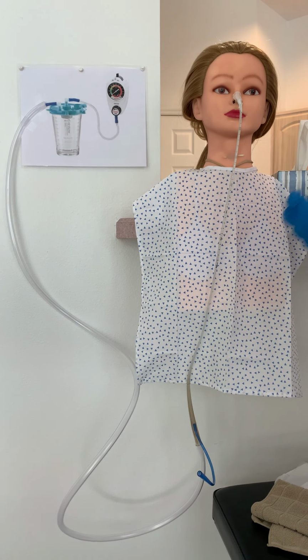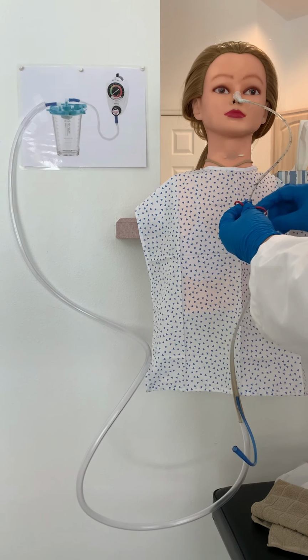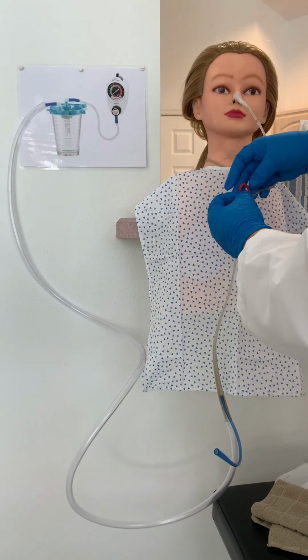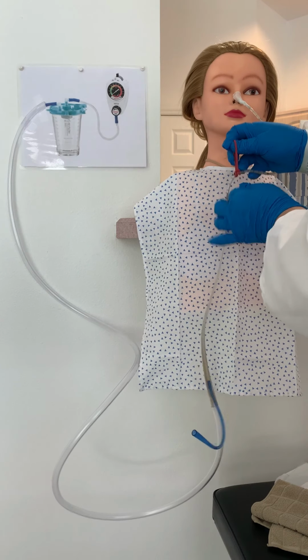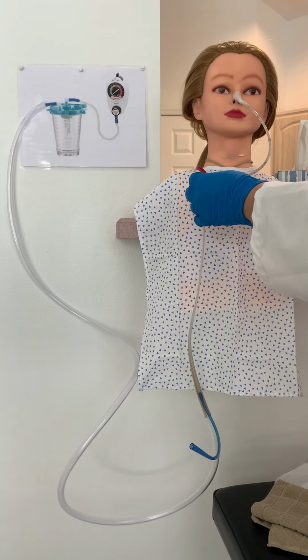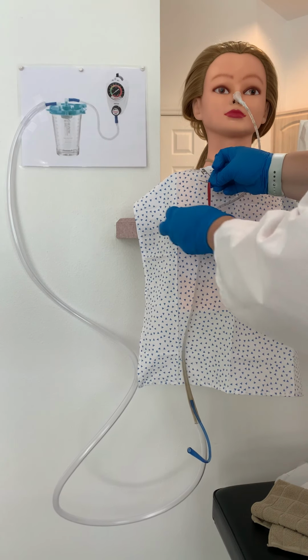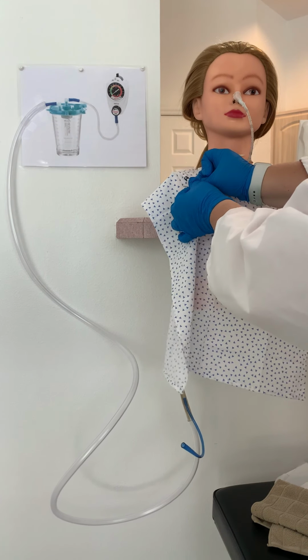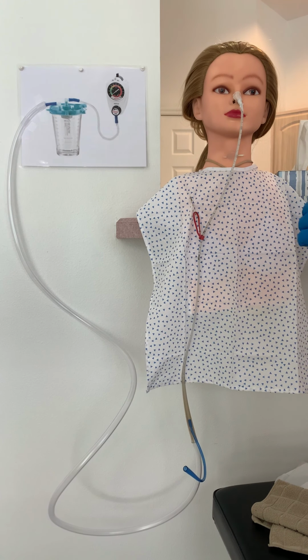So the rubber band, we're going to grab this tubing here, and we're going to loop the rubber band around it and then tuck it under itself and pull it through. See, so then it attaches there. And then we will take our safety pin and loop it through that rubber band, and we will attach it to her gown. Oops. So just like that.